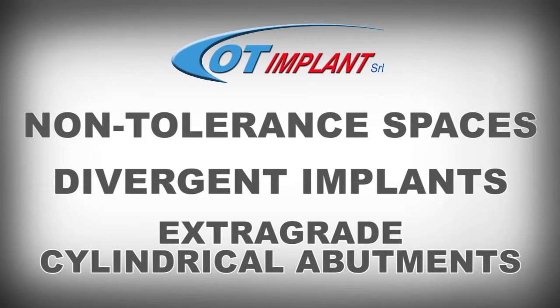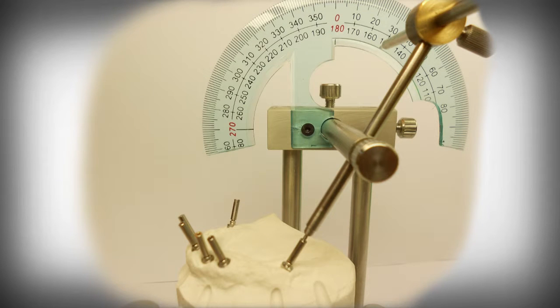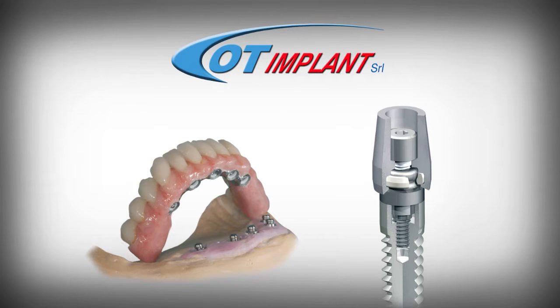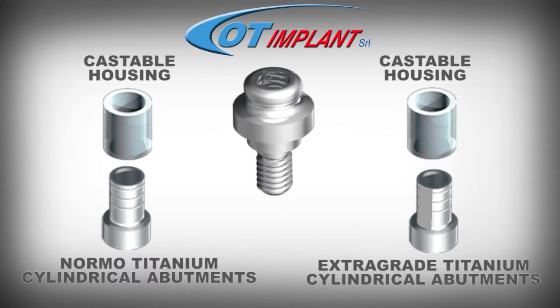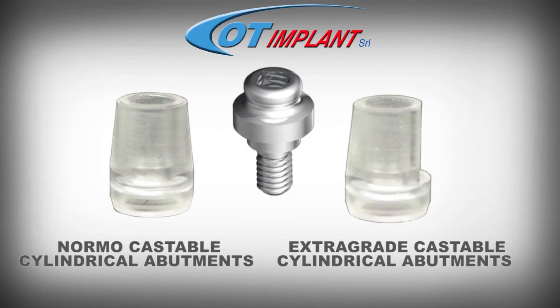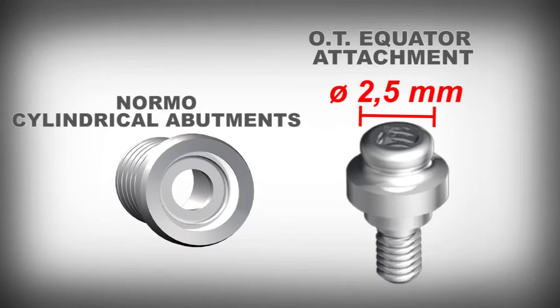Cylindrical abutments, divergent implants, from small to large tolerance spaces. Building the Seeger Bridge fixed prosthesis on models with divergent implants using the OT equator biologic attachments and titanium or castable cylindrical abutments, in order to exceed the divergences during the insertion of the prosthesis, takes advantage of the different dimensions between the 2.5 mm diameter of the OT equator sphere and the inner circular 3 mm diameter of the normo-cylindrical abutments.